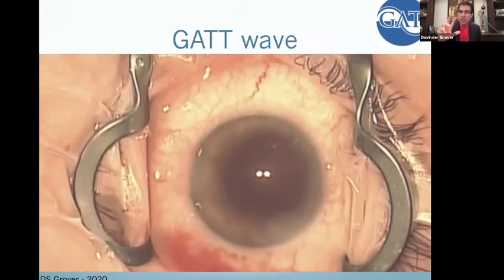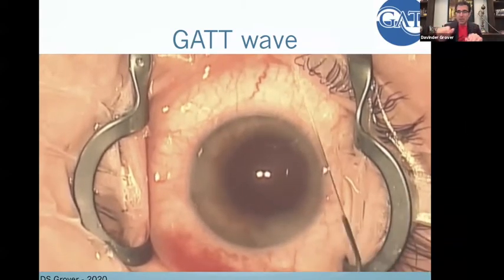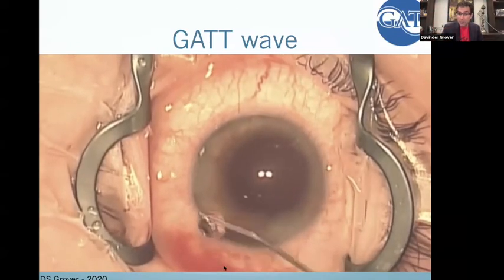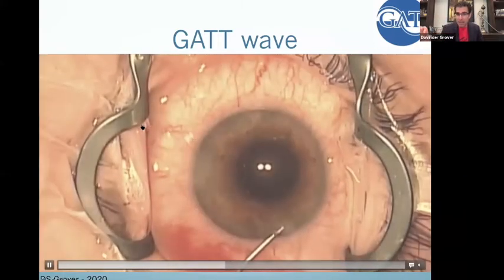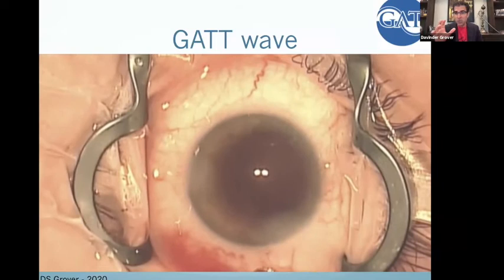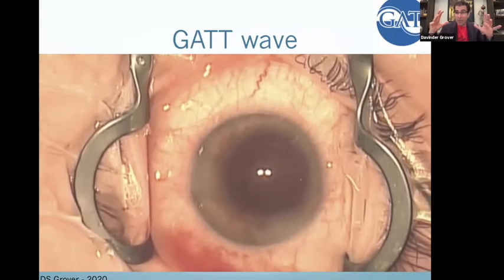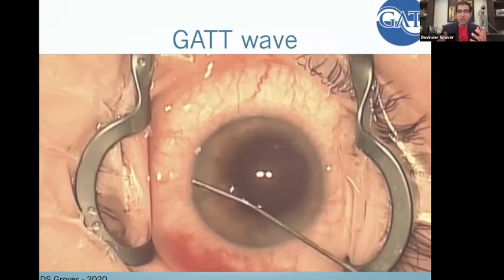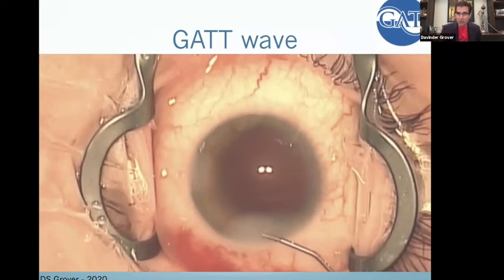And that shows you two different things. One is the kind of capacity. Two, I feel like I'm cleaning out the system, and what you can see now is how quickly the blood vessels come back. Watch how quickly the blood vessels come back and how quickly the pressure comes back to normal. And that's not all the same. There are some patients where you do this and the pressure comes down immediately, and other patients where you do this and the pressure stays up high. So I think all this is giving us more insight into understanding the patient's outflow capacity in the operating room.